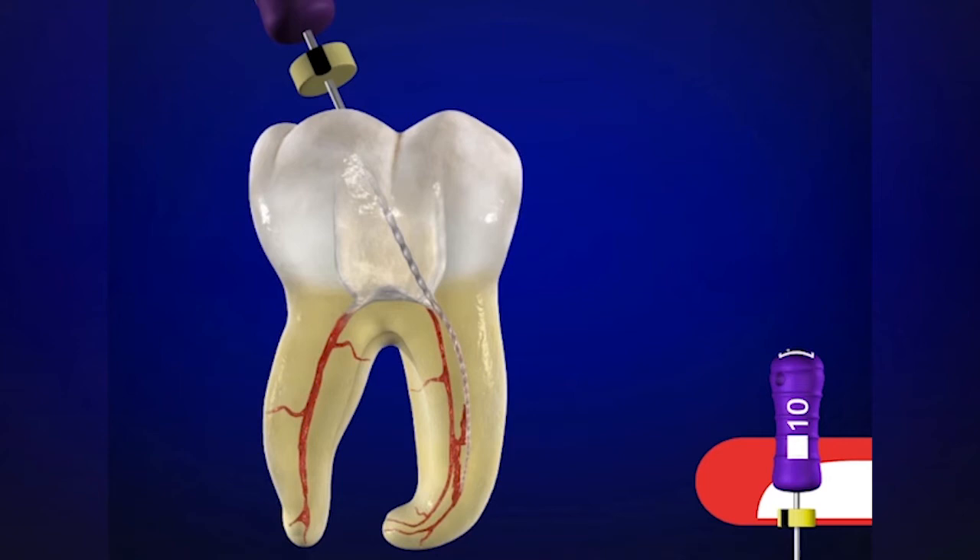Obviously in shorter, wider, and straighter canals, the instrument may want to go to length, but the handle is off-axis, so we're not going to navigate the curvature with as much competency and integrity as if we had the handle uprighted. In these instances, just take what the canal will give you, push the stop down so we know the maximum depth where the file can be easily placed, and work it up and down with little short amplitude strokes, refining, smoothing, and expanding the glide path.